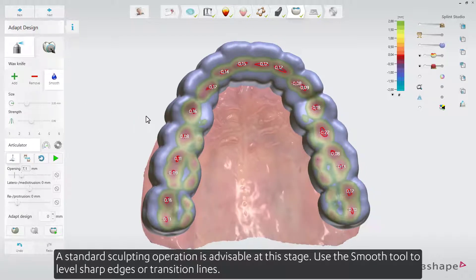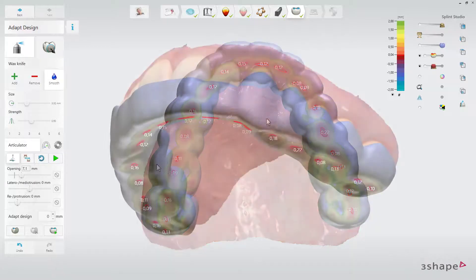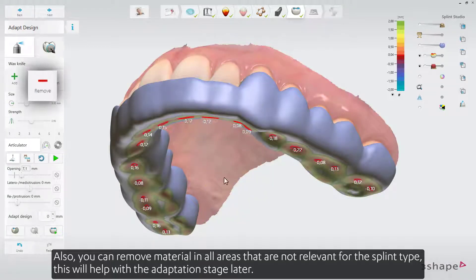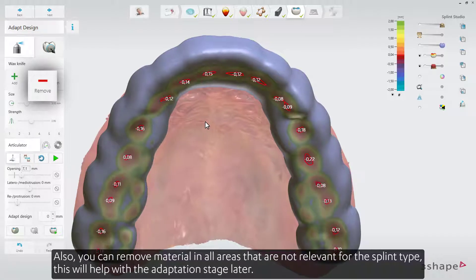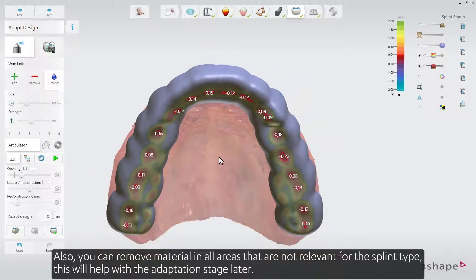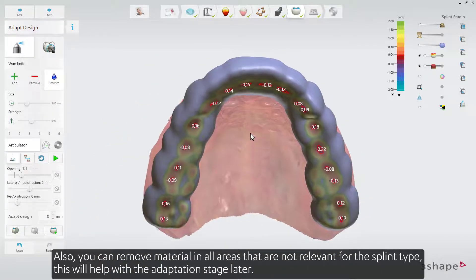A standard sculpting operation is advisable at this stage. Use the Smooth tool to level sharp edges or transition lines. Also, you can remove material in all areas that are not relevant for the splint type. This will help with the adaptation stage later.